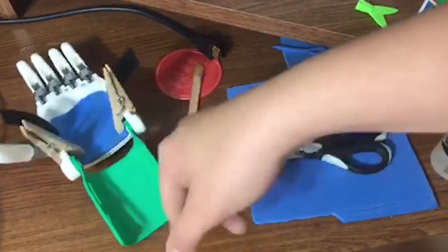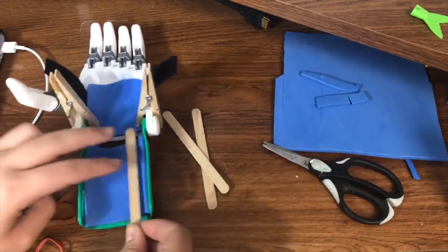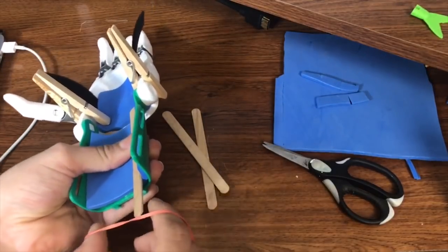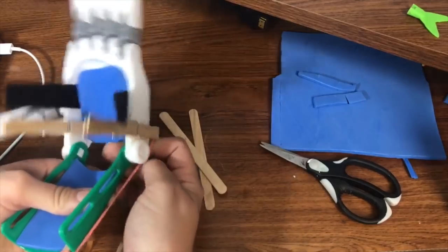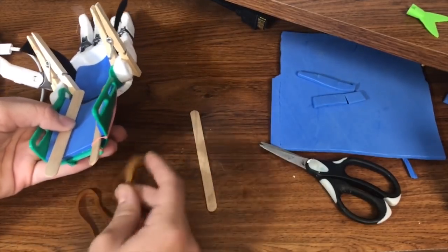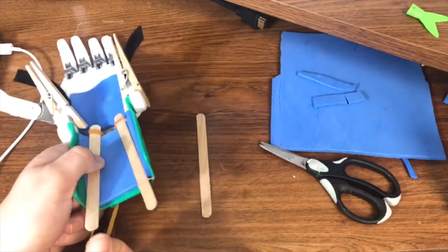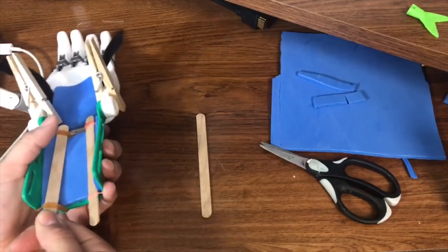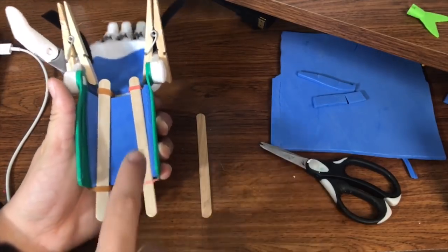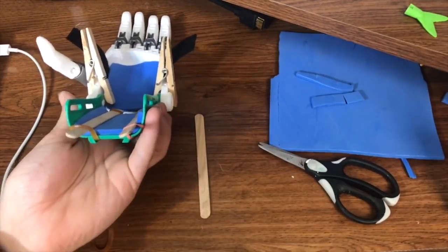We do the same exact thing for the bottom. One thing about putting padding on the bottom here — I like to secure it with some popsicle sticks. Because it's curved down here, I put it on the curve and put the popsicle sticks like this, and use some rubber bands to hold it down. Make sure you put the velcro on before you actually string everything up, or else this part would be very hard to do because you wouldn't have the movement of the wrist. Make sure everything is aligned with no gaps.